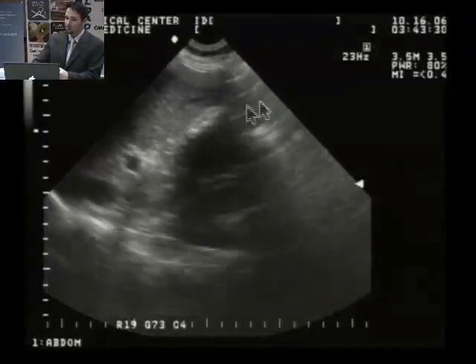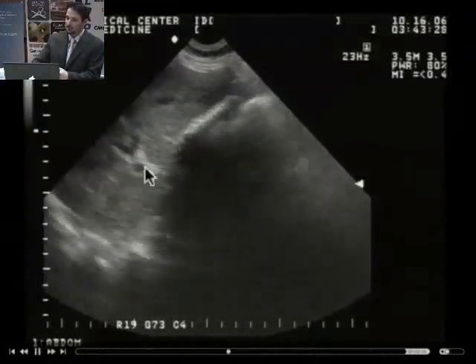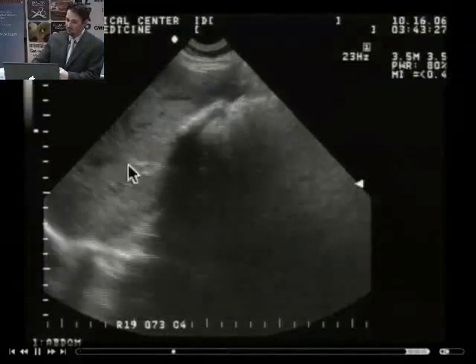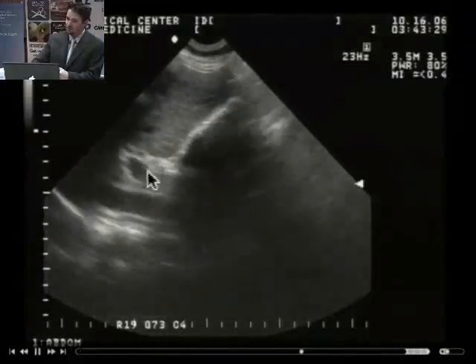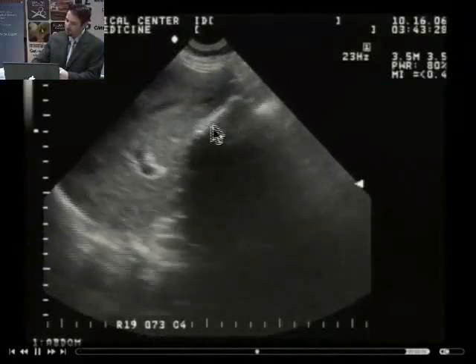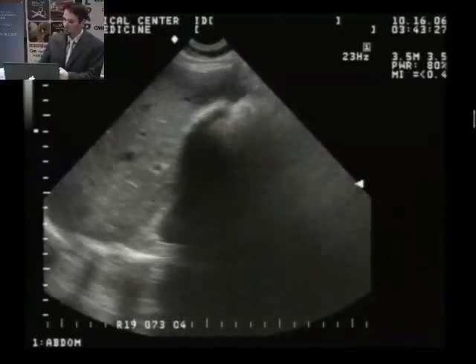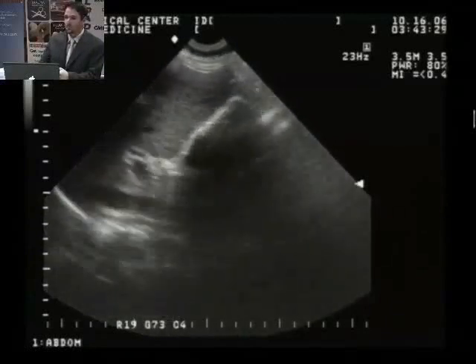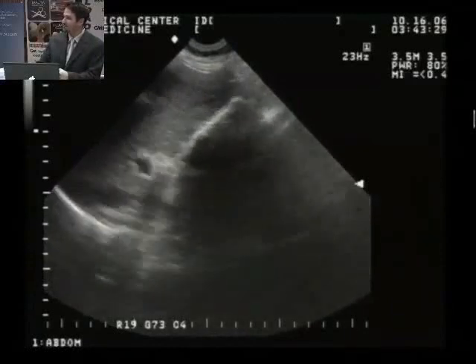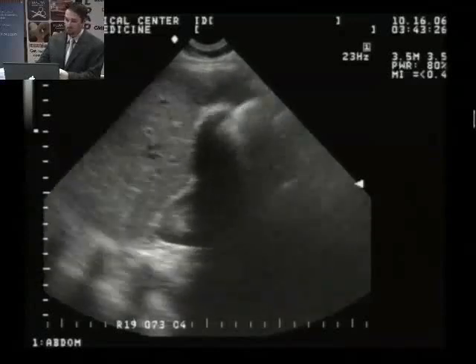All right, now, again, we're scanning right upper quadrant. You've got the liver here. Here you've got the north pole, the portal vein, intermittently here. Here it is, kind of guiding you to where you expect to see the gallbladder. So if it's that exclamation sign, you should expect the gallbladder right here. Instead, what you see is one dense shadow. What's going on with this patient? Has this patient had their gallbladder removed, and did the surgeon have dirty hands and leave something behind that might shadow? I guess that's possible.